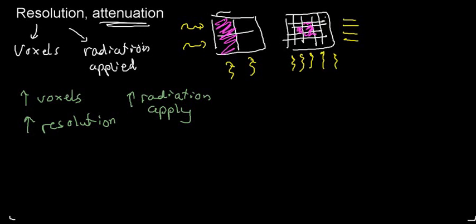And now I want to talk about the idea of attenuation. We've discussed attenuation and absorption interchangeably, but we can break them apart.